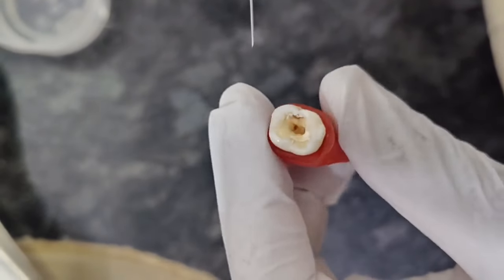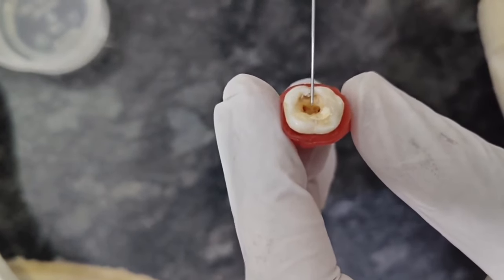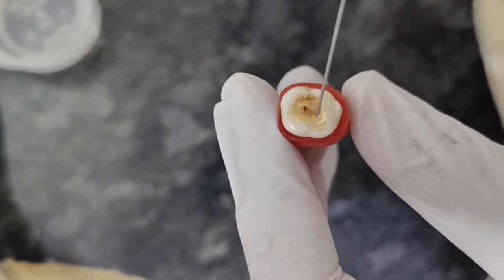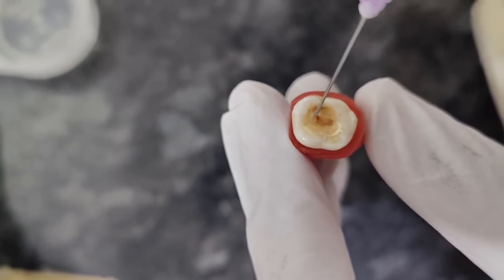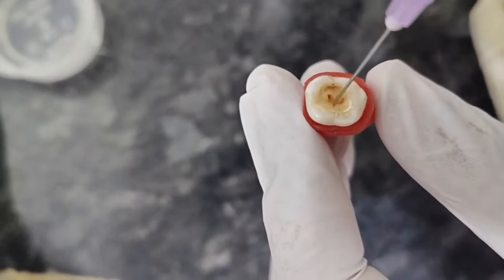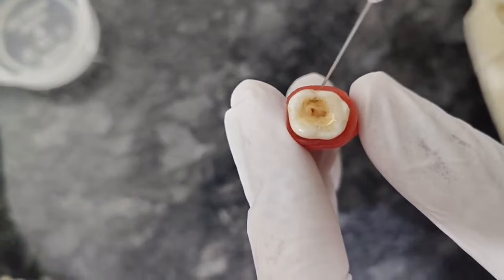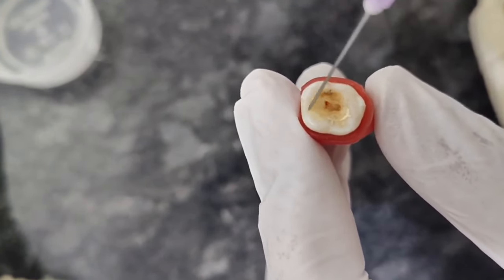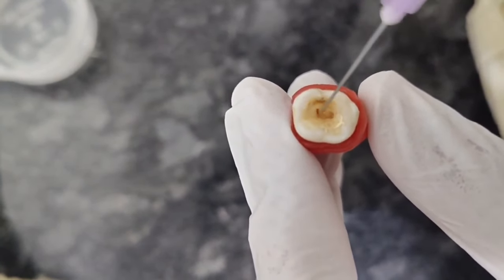So after the access opening of the teeth, what I usually do is I put 2 drops or 3 drops of EDTA liquid onto the surface of the canal. It's not always necessary that the carious tooth will be in the middle. Sometimes the carious tooth can be on the sides, on the proximal area. So if you're a new beginner, what I suggest is first build up the tooth with GIC or composite. After building up, you make the access opening like this. Building up means wherever caries is there, you remove the caries. Then you build up that particular area with composite.